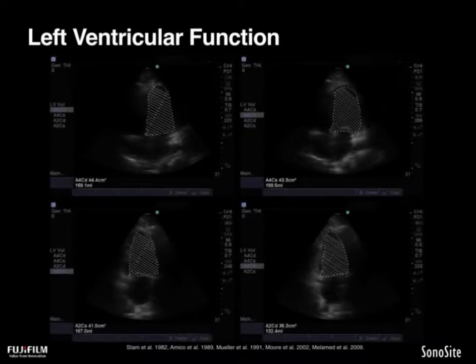By comparison, the ejection fraction method is cumbersome and quite involved. You need 2 orthogonal views, typically apical 4-chamber and an apical 2-chamber view, and these views then need to be captured at end systole and end diastole with the left ventricular volume measured using special calipers at each of these states. The machine is then able to do some heavy lifting of Simpson's biplane method of discs, as it's called, and generate a number for you.